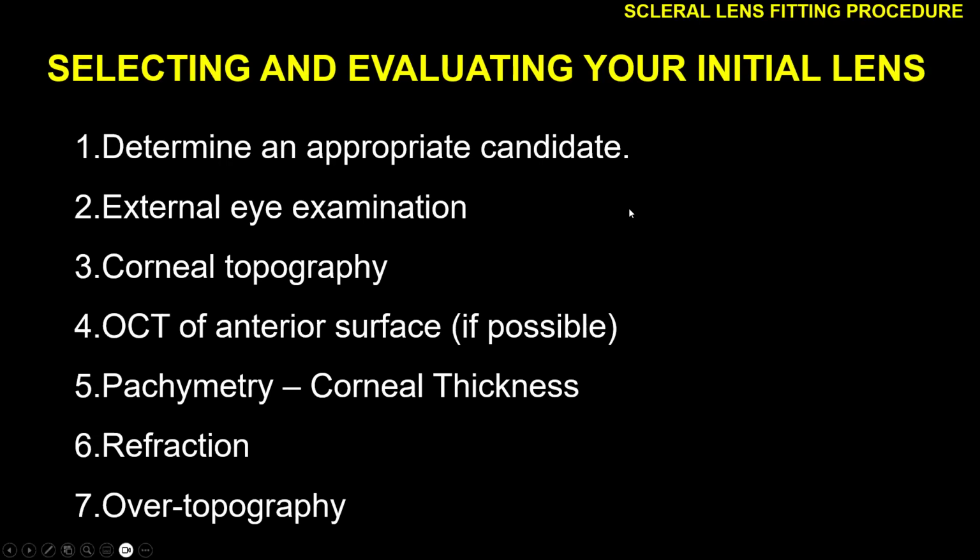Okay. So again, you have to determine an appropriate candidate for the contact lens. Motivation, all of that is necessary for you to do, and to be sure that the patient wants it. For instance, if a patient wants just a contact lens for something you think is not necessary, that other lenses may easily solve, and the patient can still get what he wants, that's okay if the patient is motivated and wants to get that scleral contact lens. But what is important is the motivation.